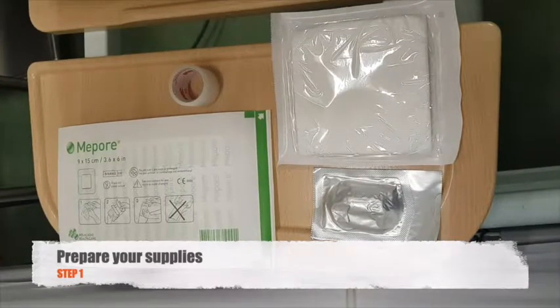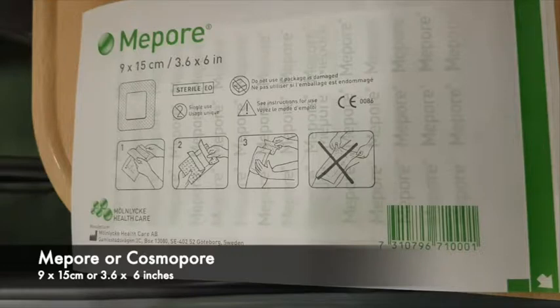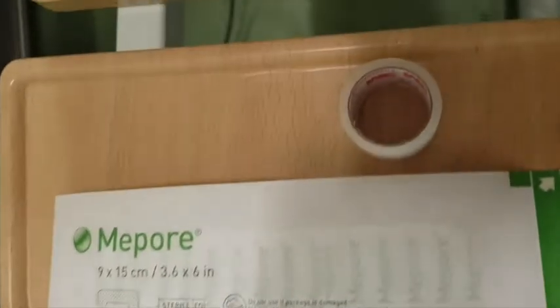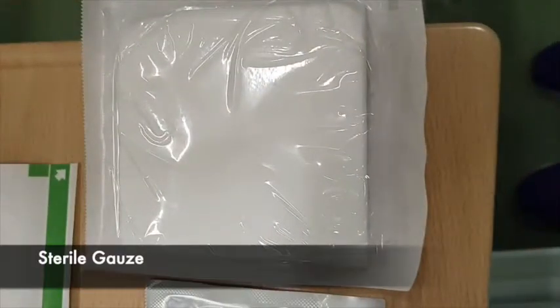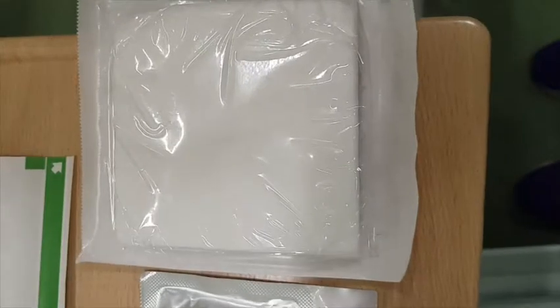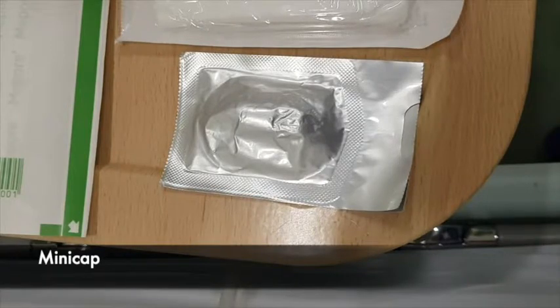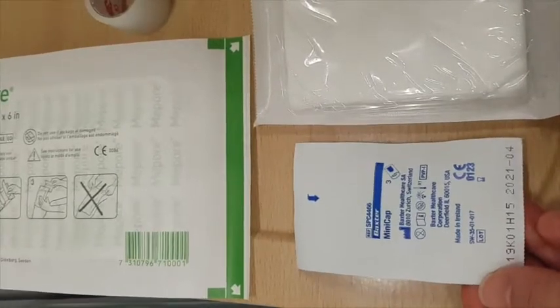Before starting to end your treatment, prepare your supplies. You will need a Mipore or Cosmopore which is 9 x 15 cm or 3.6 x 6 inches, a TransPore or MicroPore Tape, and a Sterile Gauze. You will also need a Mini Cap. Remember to check your expiry dates.